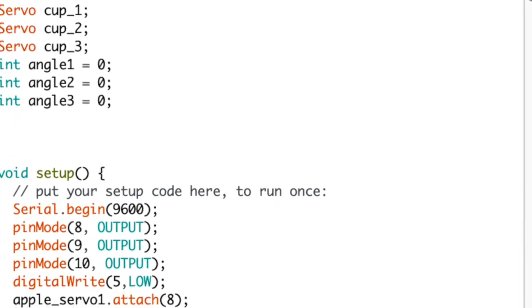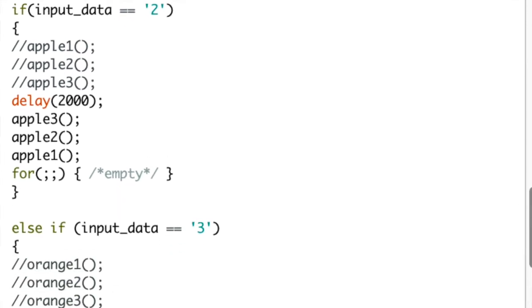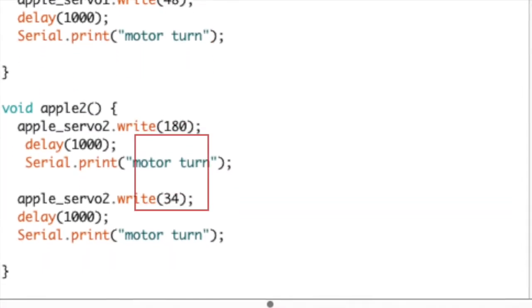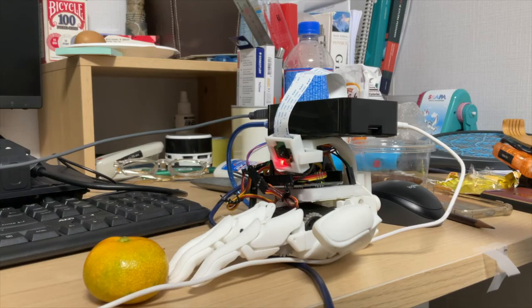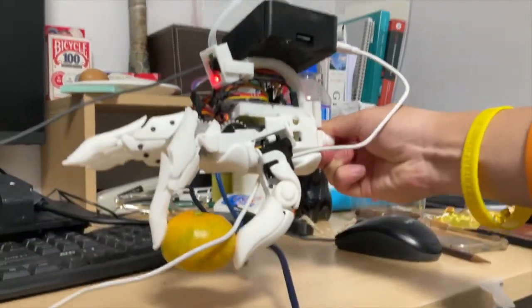As for the Arduino code, the code is relatively simple. Using the example from earlier, once receiving the specific binary number 2 from the Raspberry Pi, each of the fingers are moved to a specific angle that is ideal for holding an apple. Since the orange detected is small, the code is designed to hold a small, circular object.